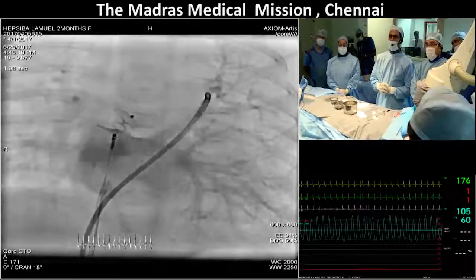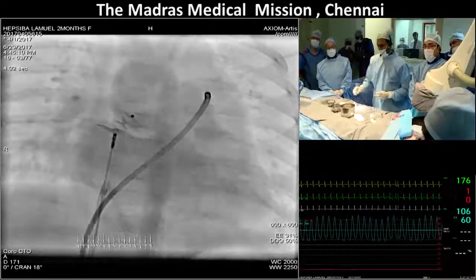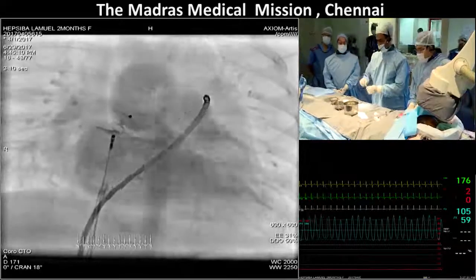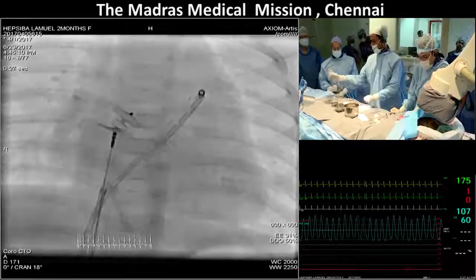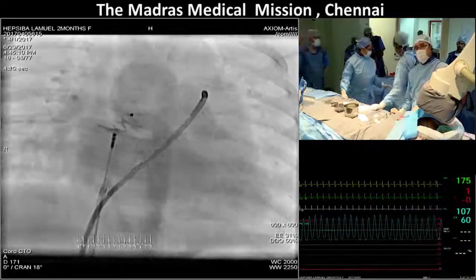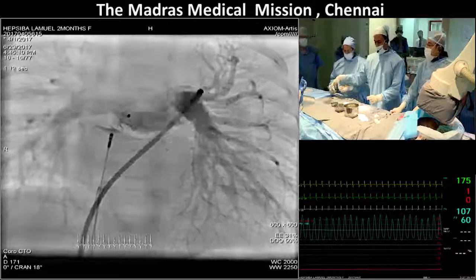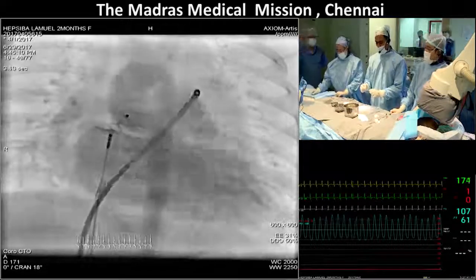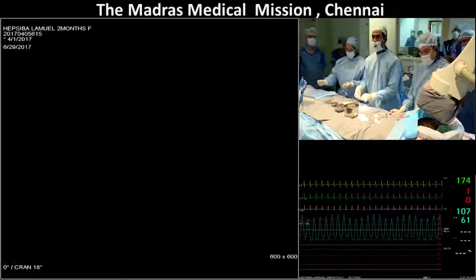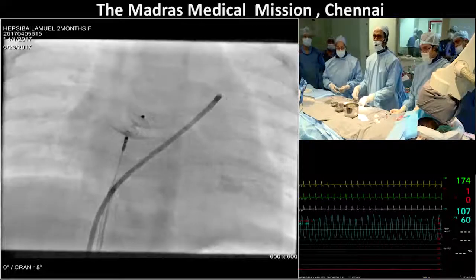You don't have to worry about that at all. The only thing you have to worry about is the left. That looks pretty good. I agree. What I will try to do is get my catheter deeper into the right pulmonary artery and try to give a better angiogram, because right now my catheter is more into the main pulmonary artery.